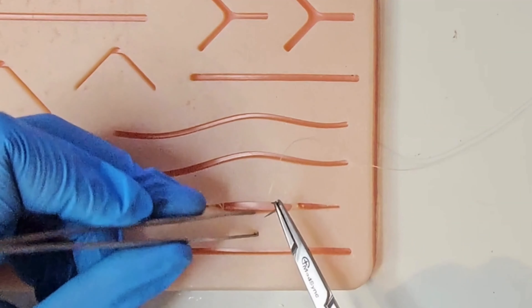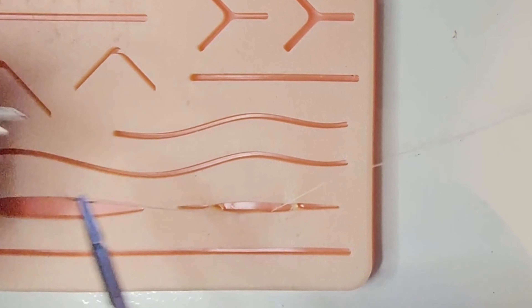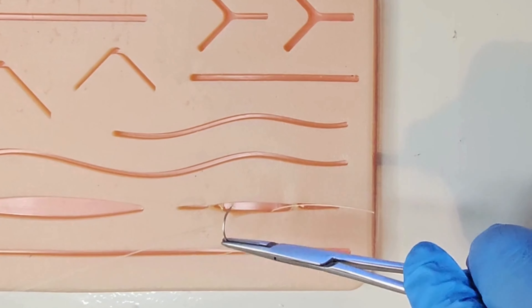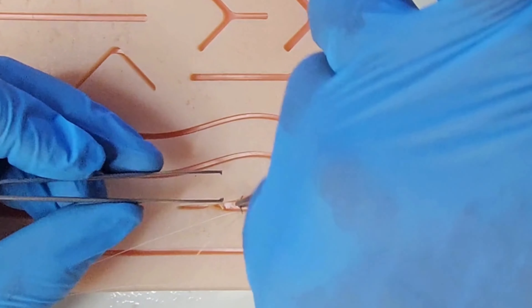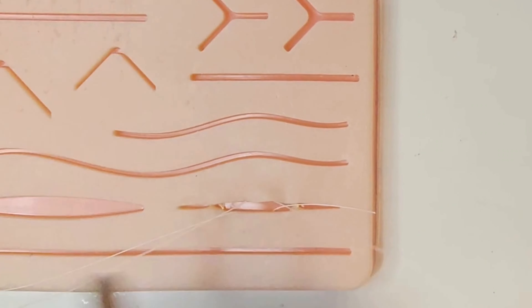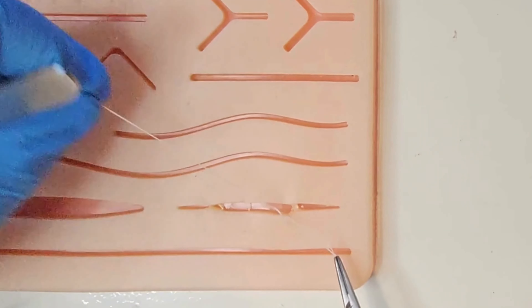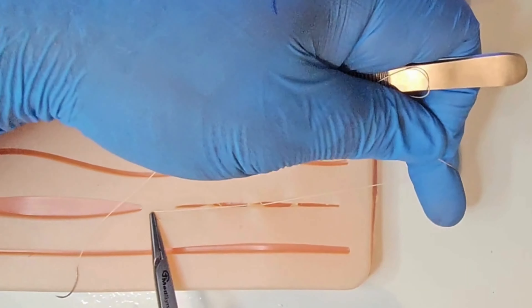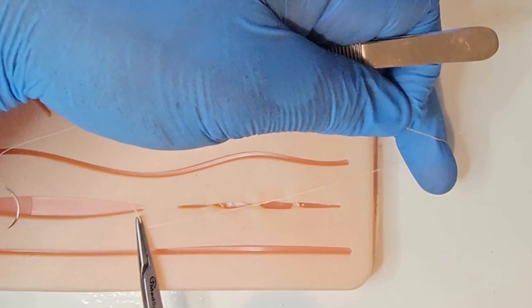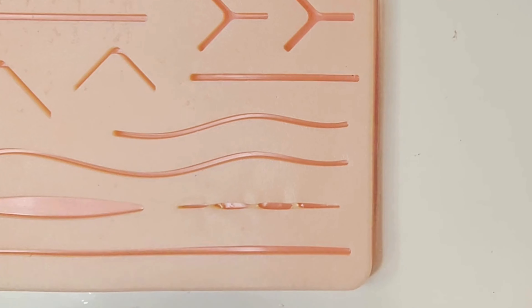Pass from deep to superficial on the side closest to you, then pronate the needle and go from superficial to deep on the side furthest away. Tie your knots in parallel to the wound, alternating the lie of the suture ends, laying secure square knots each time. Cut flush with the skin. Now you have obliterated the dead space and reduced the tension.